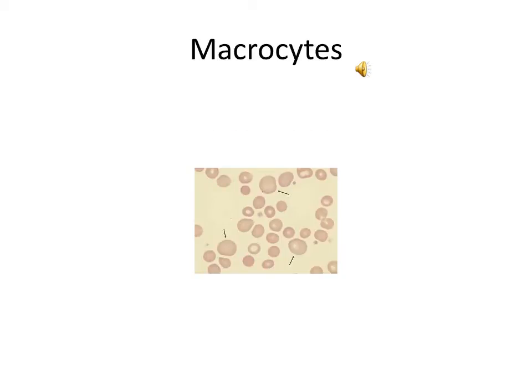The cells being pointed to in this picture are macrocytic red blood cells. They're red blood cells that are approximately 9 micrometers or larger. The MCV is greater than 100 femtoliters. There are a few reasons you get macrocytes. One mechanism is impaired DNA synthesis, which results in megaloblastic erythropoiesis. This leads to a decreased number of cellular divisions, therefore a larger cell. This produces a megaloblastic anemia, which can be the result of B12 or folate deficiency, chemotherapy, or any process producing a nuclear maturation defect.